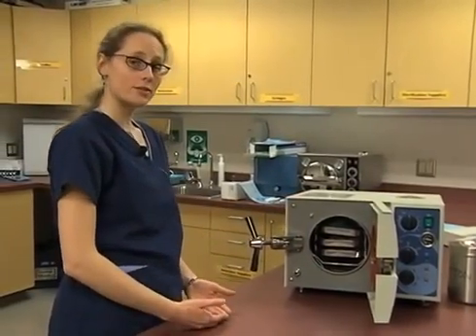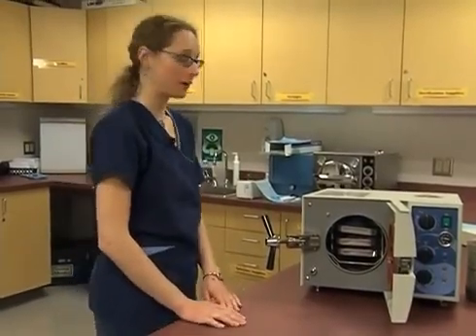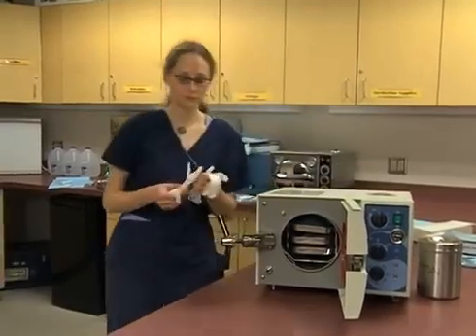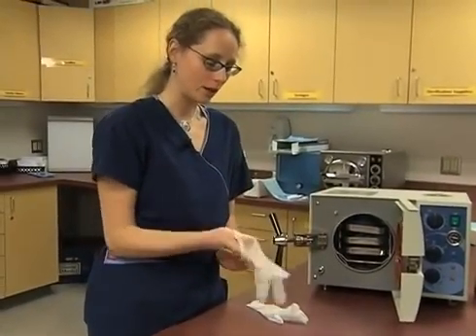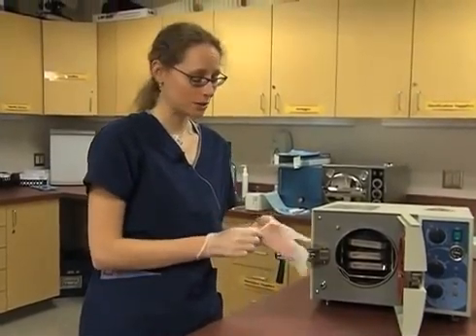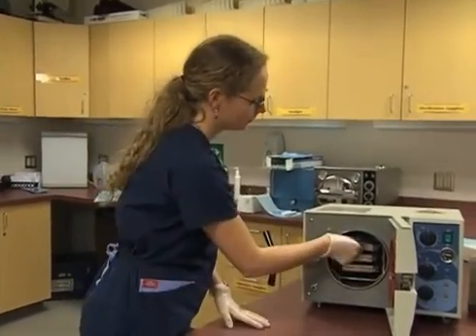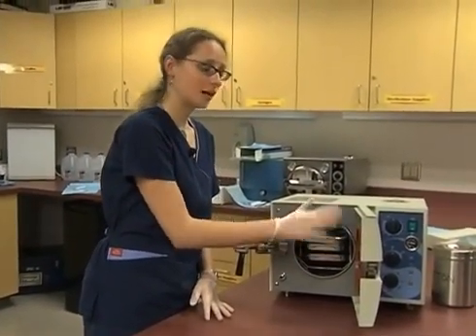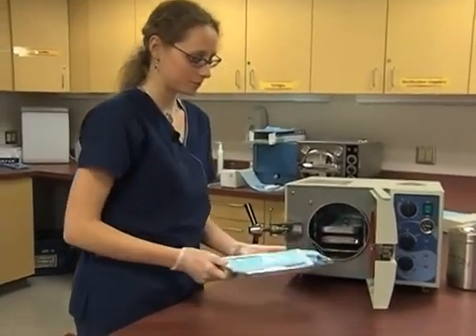When we remove them, some offices have different procedures for putting the items away. Our office has us wear gloves when we handle things that have been sterilized and put away. This is especially important if you have any breaks or sores on your skin or any dry skin. A lot of procedures have to be done with gloves on to make sure that we're protecting our patients. When we remove it, it should be cool to the touch. Sometimes after it's done, this can be quite hot and needs time to cool. But if it's ready to go, we can pull it out.